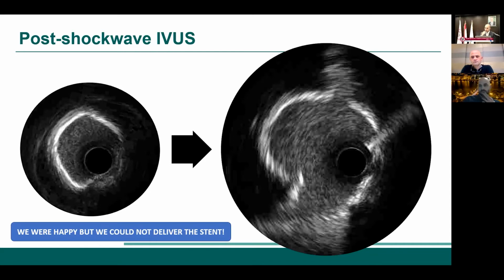Comment. You answered my question already with your comment, because generally we can see a lesion that we dilate very well, but the stent cannot pass, and most likely there is, in our way through this lesion, a bulky lesion that we cannot see with only multiple orthogonal views. It is not generally the anatomy or kinking that prevents delivering the stent.